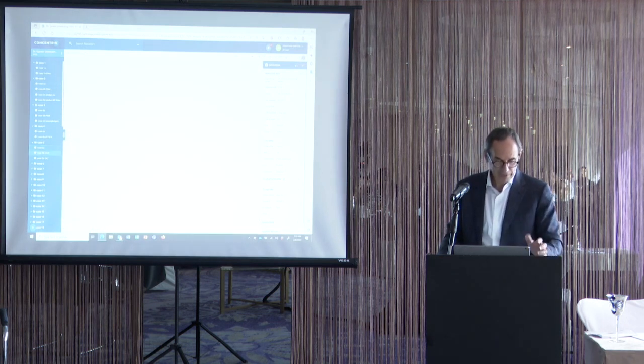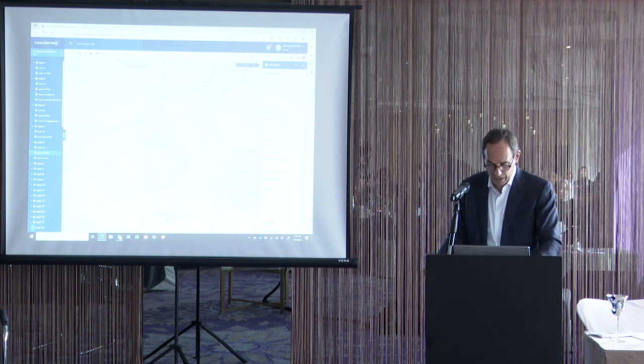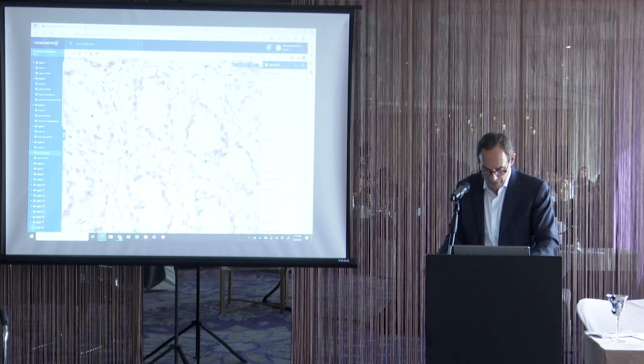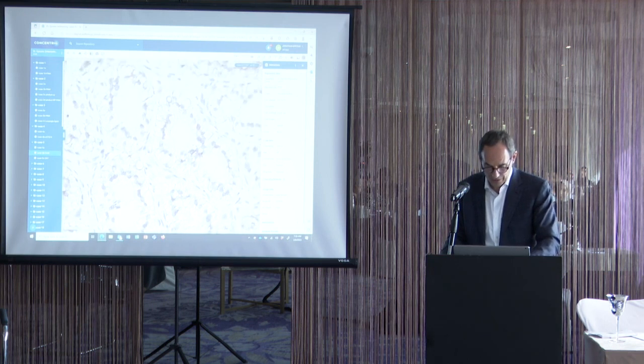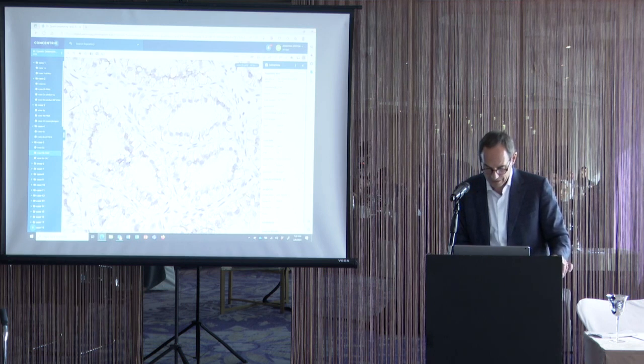And then, if you're not sure of it, the stains you want to do are CA9. It should be diffuse CA9. And we talked about the cup shapes. To look at the cup shapes, you want to go into some of these little tubular areas. Basically what you're seeing is more staining along the lateral edges and not as much on the surface component. For example, if you look at a cell like this here in the middle, you have staining on the sides and on the bottom, but not on the surface.